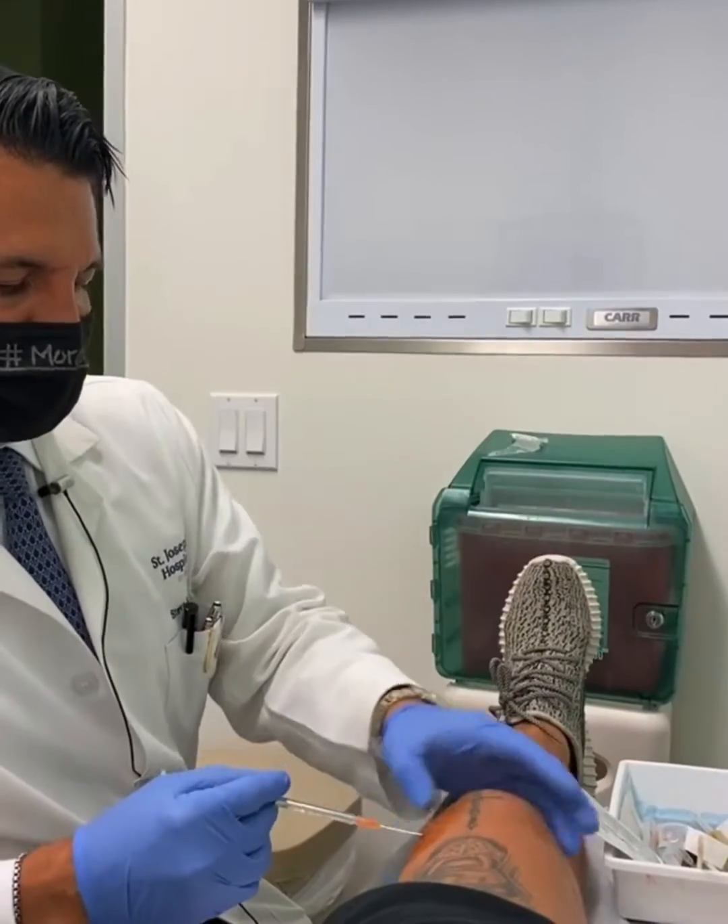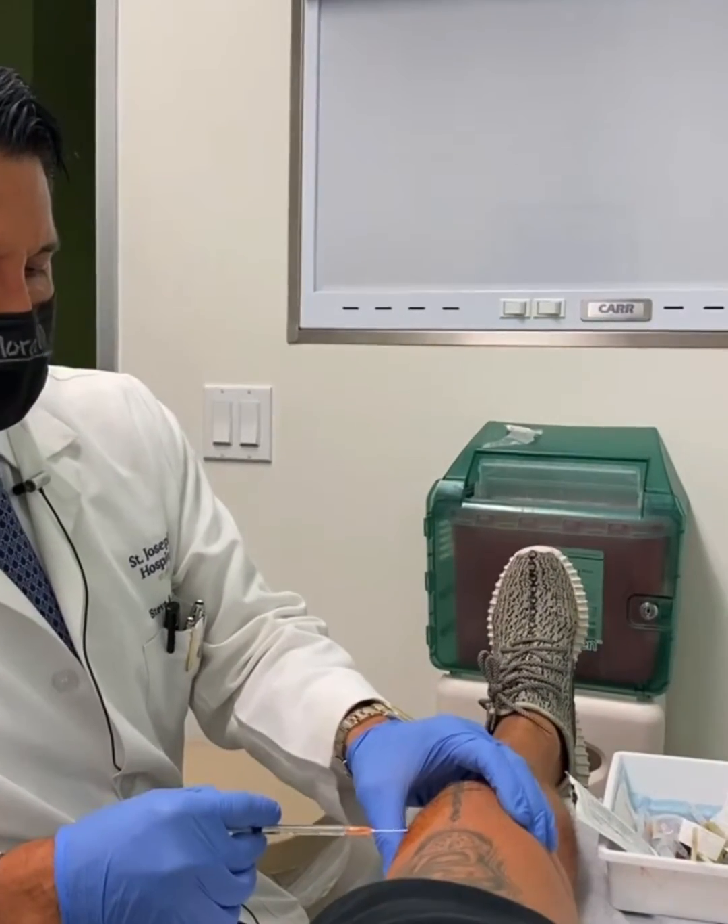Ready here. I do this — take a little, get a little shake. You doing okay so far, TJ? Mm-hmm. Okay.